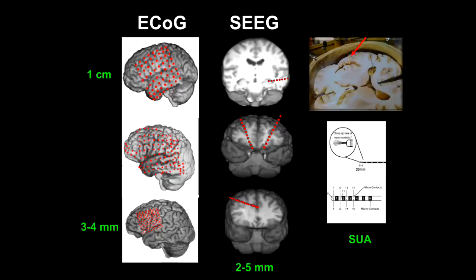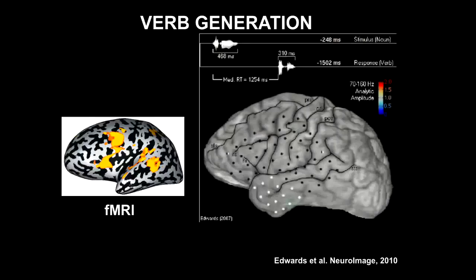See the very small holes drilled, stereotactically implanted. And you can see this is targeting the hippocampus. This is memory, orbitofrontal cortex. Pick your poison in terms of social, emotional. Cingulate, one of Colin's interests in terms of response selection and monitoring and surprise. And then in some cases, and the cases that we just did, at the very end of the electrode, you can push out a few fine microwires, and in humans actually record single unit activity, which is an amazing development in the last maybe 10 years.